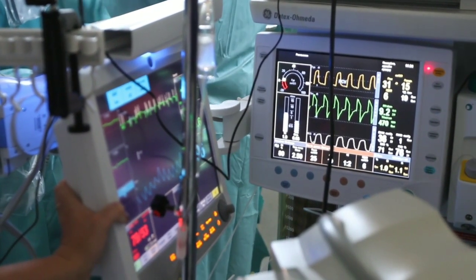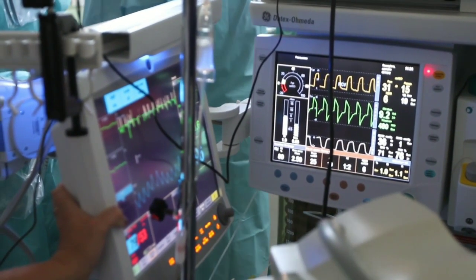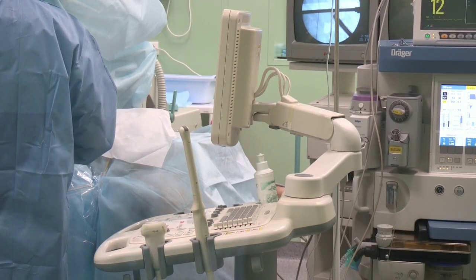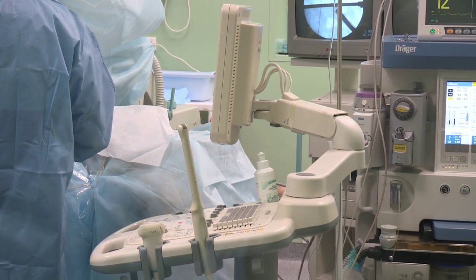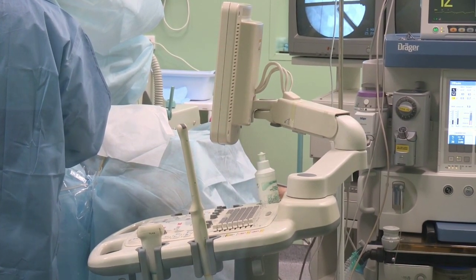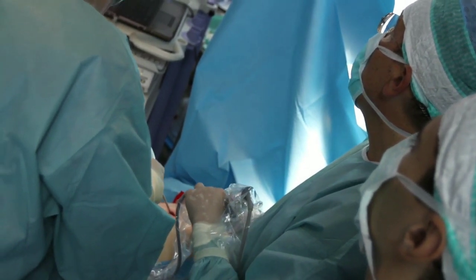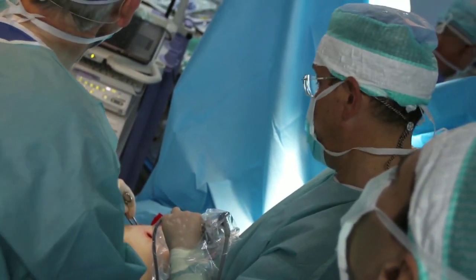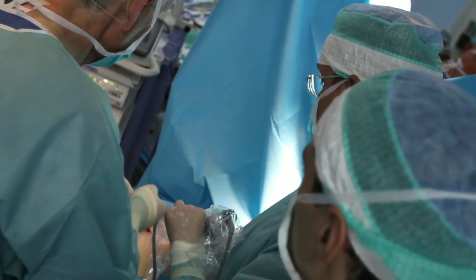This is quite complex. Single-channel ECGs record the electrical signals from only one lead — probably one area configuration — at the same time.